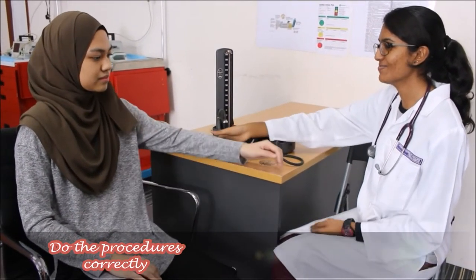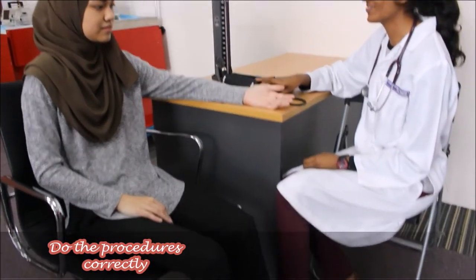To begin, place the patient's forearm on the table with the palm facing upward. Make sure both feet are placed flat on the floor.